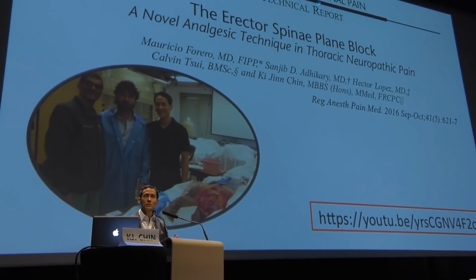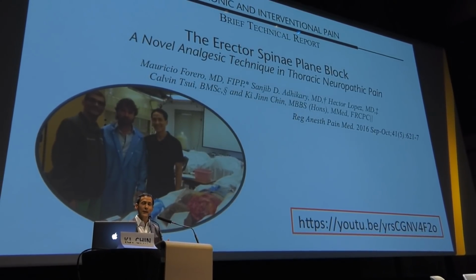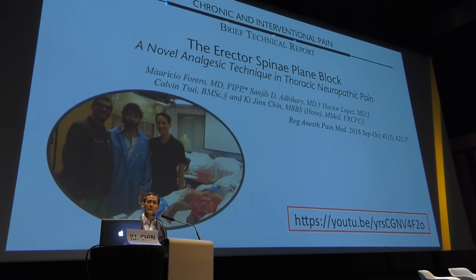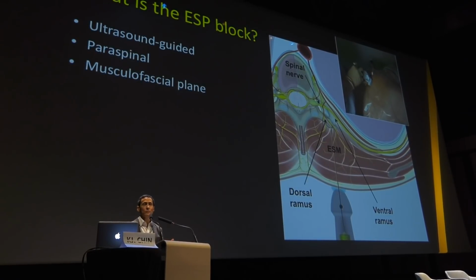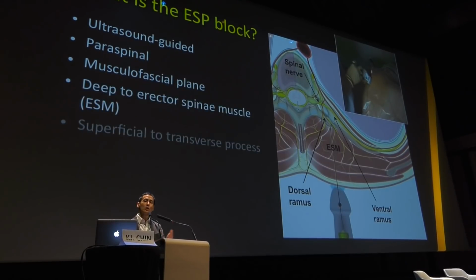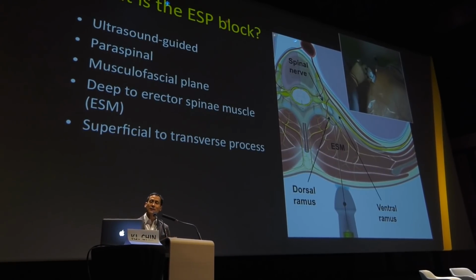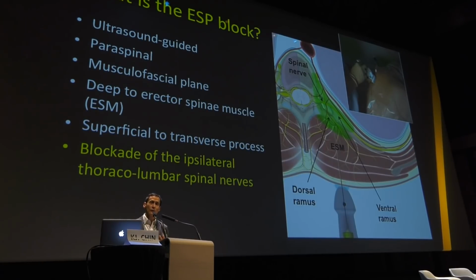And I would like to present to you today that the erector spinae plane block, which we described back in 2016, is perhaps a valuable technique because it meets many of those criteria. So what is the ESP block? For those of you that are not familiar with it, this is an ultrasound-guided paraspinal block into a musculofascial plane that's located between the erector spinae muscle and the transverse process. And by injecting in this area, we're able to anesthetize the dorsal ramus of the spinal nerve, the ventral ramus of the spinal nerve, and achieve a blockade of the ipsilateral thoracolumbar spinal nerves, and thus provide anesthesia of the trunk primarily.